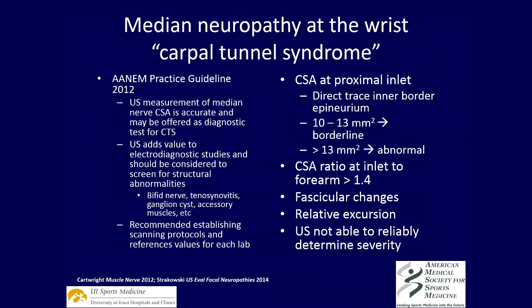In terms of a carpal tunnel diagnosis, the AANEM practice guidelines did state that ultrasound measurements of the median nerve cross-sectional area is an accurate measure and may be offered as a diagnostic test for carpal tunnel syndrome. They also acknowledge that ultrasound adds value to electrodiagnostic studies in terms of identifying potential anatomic reasons for compression in the area, such as those that we've mentioned already.